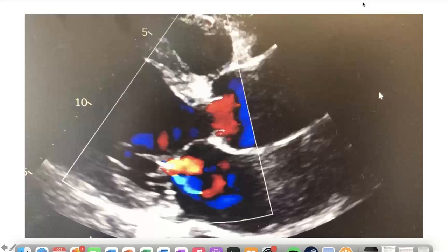And there is a bit of a difference between the measurements in the aorta. Just as you know, you tend to go from outer edge to outer edge, whereas we do measure it a bit differently. But Mark and the surgeons are pretty happy in sort of extrapolating what we've measured at the moment. But of course, we would recommend you get the CT or the MR as part of that process, along with, like you suggested, the TEE, to help then understand the likelihood of repairability of the valve, and to avoid replacing the valve. So, that's absolutely part of the aortic evaluation, is looking at the aorta.